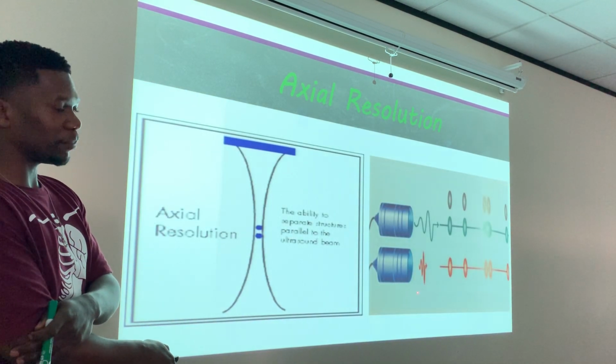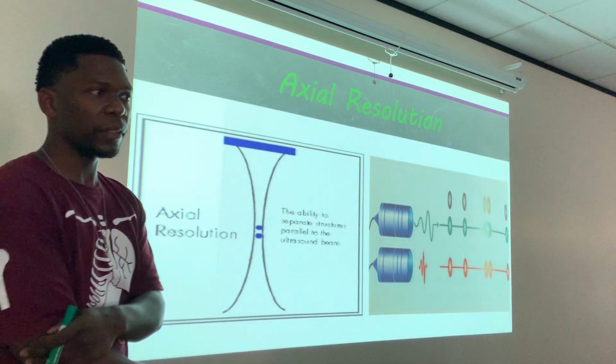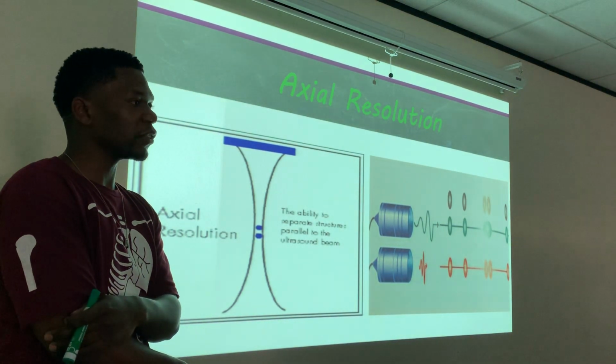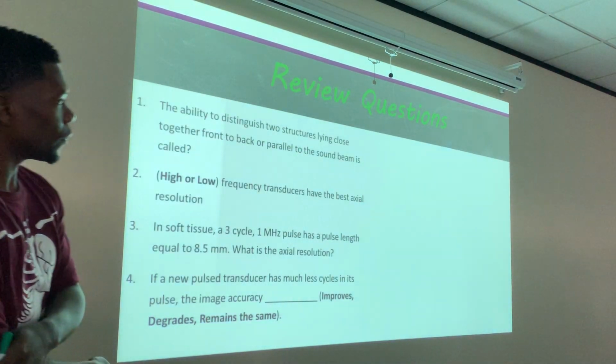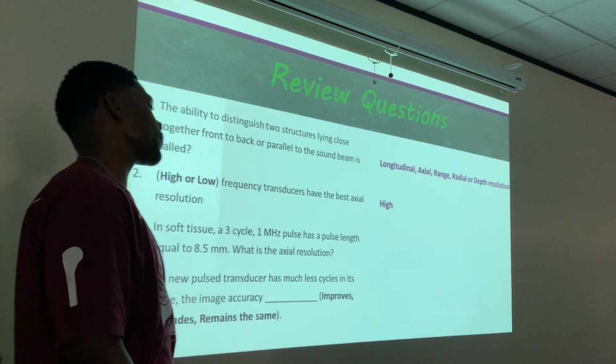A higher frequency transducer is better able to distinguish two structures that align parallel to the sound beam's main axis if they're close together. Okay? So definitely, good job. High frequency transducers.